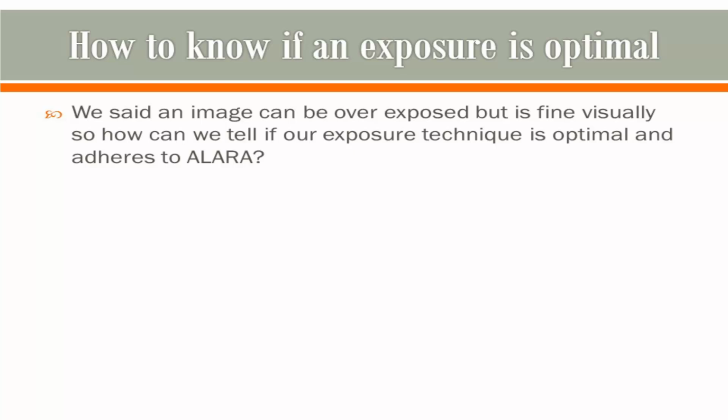optimal and adheres to ALARA, or as low as reasonably achievable? Overexposing 3, 4, 5, or 6 times and the image looks fine doesn't sit well with me, and I hope it concerns you as well. I don't know any technologist that wants to overexpose patients, but it happens, so there has to be another way to let us know we are overexposing patients.